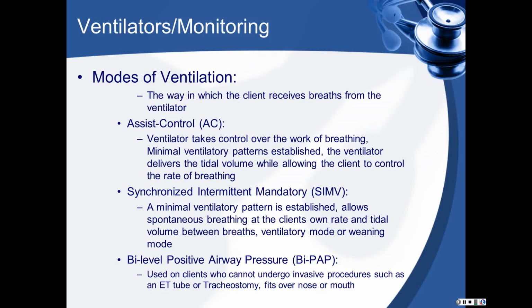Synchronized intermittent mandatory ventilation is similar to the assist control ventilation in that a tidal volume and a ventilatory rate are preset. But unlike the AC vent, your SIMV allows for your patient's spontaneous breathing at their own rate and tidal volume in between the delivered ventilator breaths.